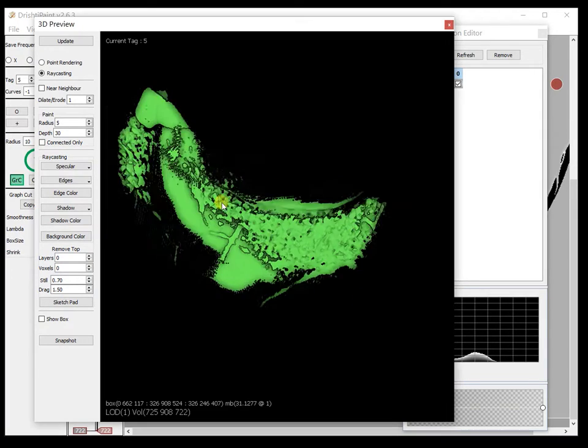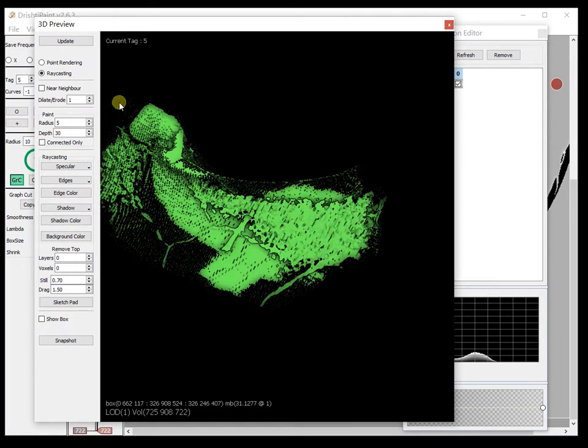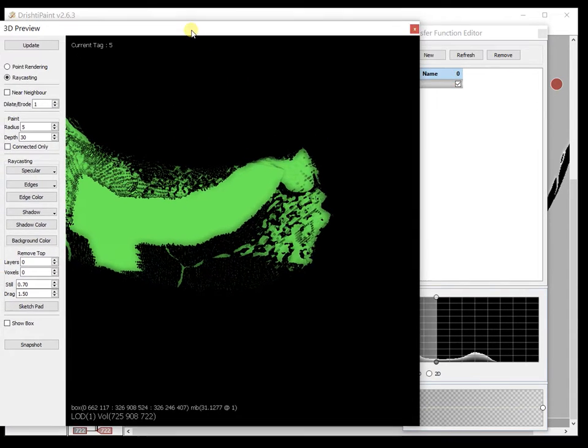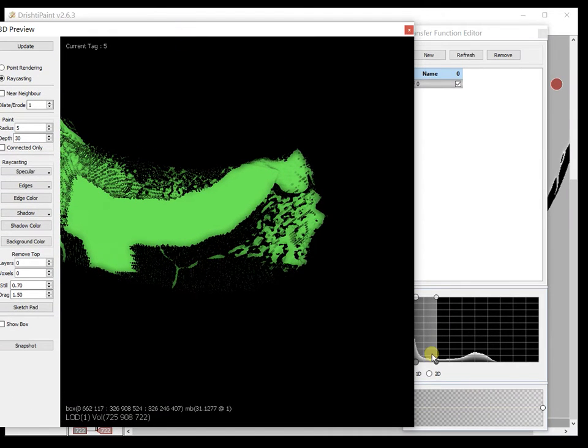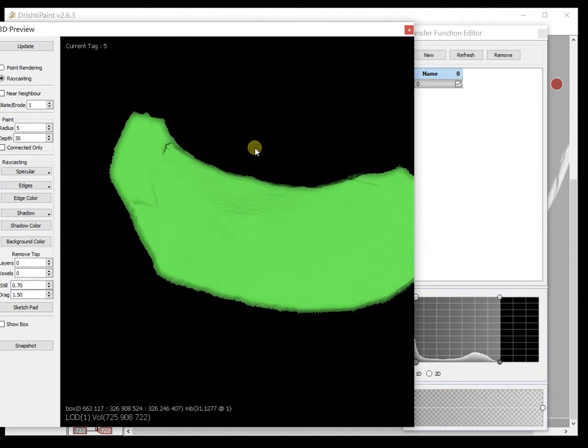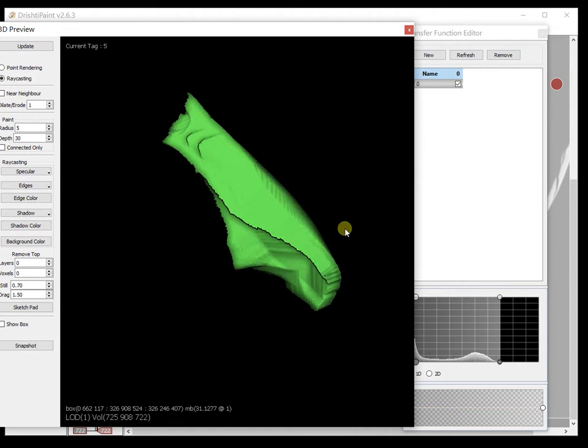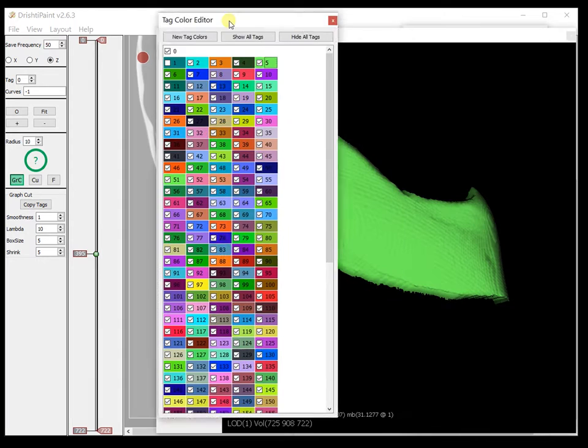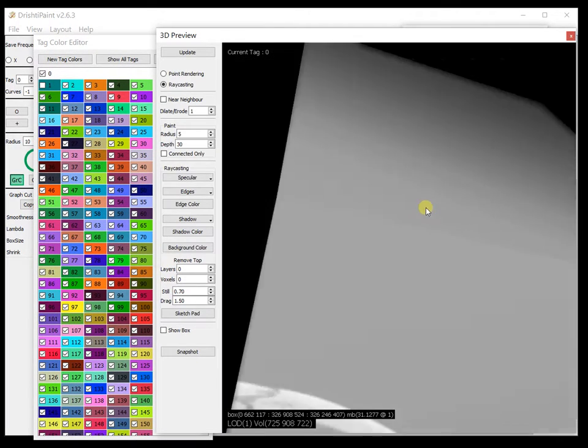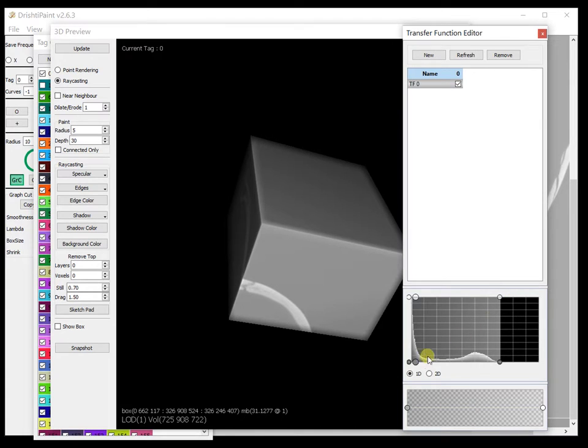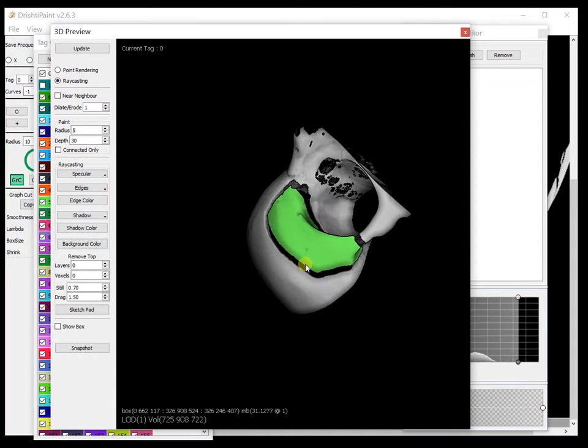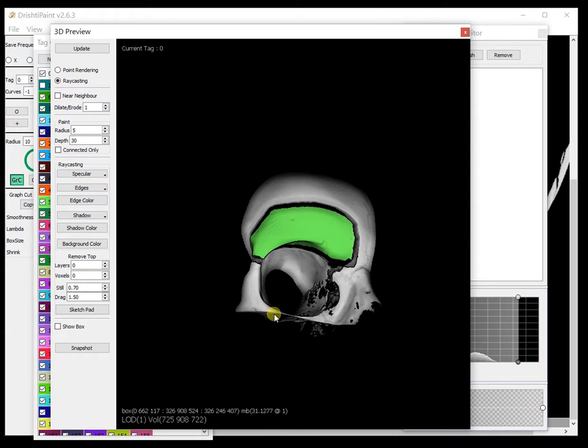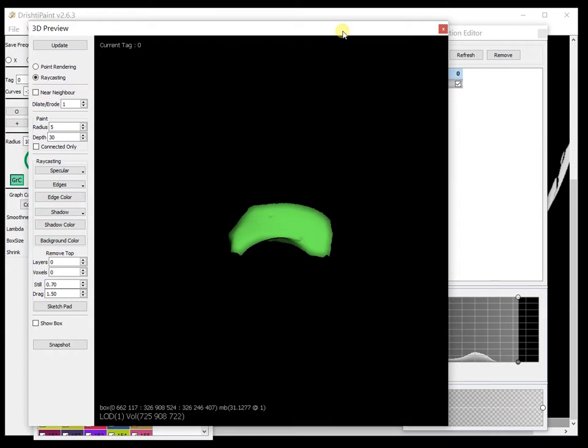In the previous video we saw the segmentation or marking of this region, the orbital bone here, which is this region of the skull. Let me also show you the skull. Let me turn on tag zero. So this is what we have isolated from the skull and we now want to isolate within that part the pores.